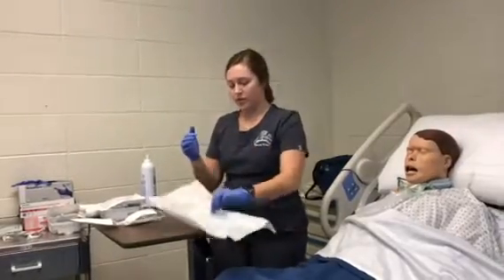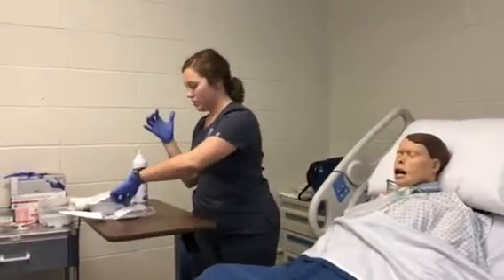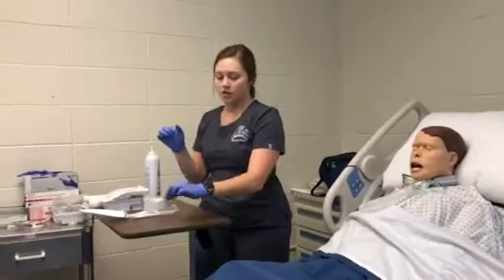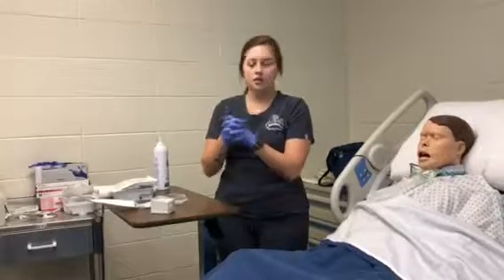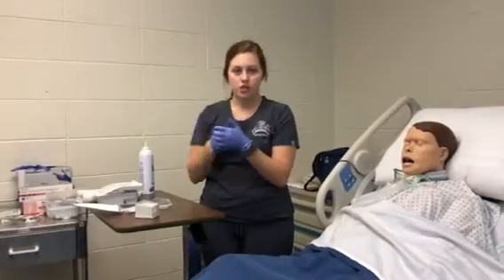Okay, and now this can go in the trash can. And this is a little basin for saline. We're just going to simulate that today. Normally, if you were doing this, you will pour saline in here, and that's what you use to flush your suction catheter out with.